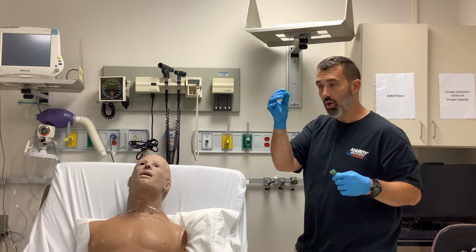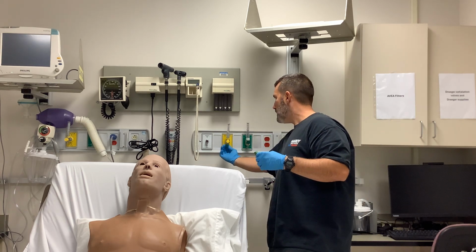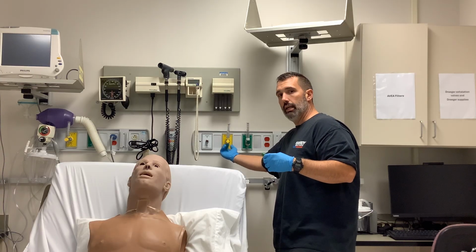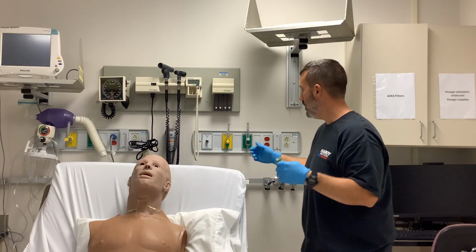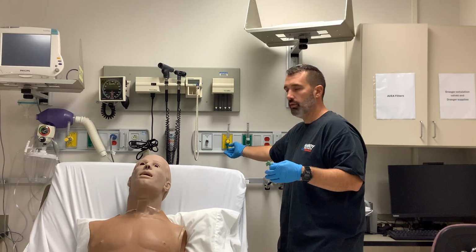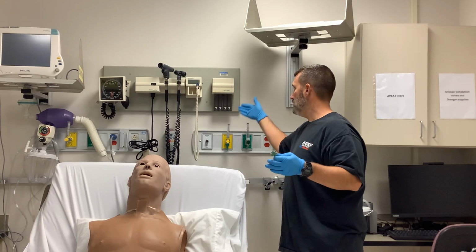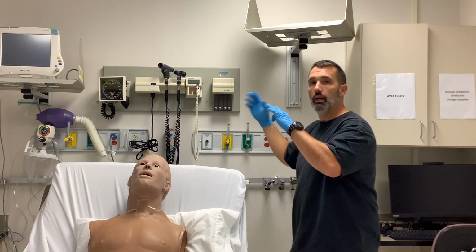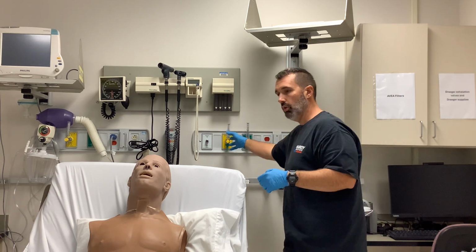In a hurry, if you are identifying green with oxygen, if I happen to place this here and you're in a life-threatening code blue type situation, at a glance you see the green Christmas tree adapter, nipple adapter, barbed adapter, however you want to call it, and you attach your tubing here for your oxygen delivery device. The highest amount of oxygen possible you can provide to that patient is 21%, because it's 21% that's going to come from the wall. Doesn't matter if you turn it 2 liter, 3 liter, 4 liter, what have you. It's all 21% that's coming from the airflow meter.